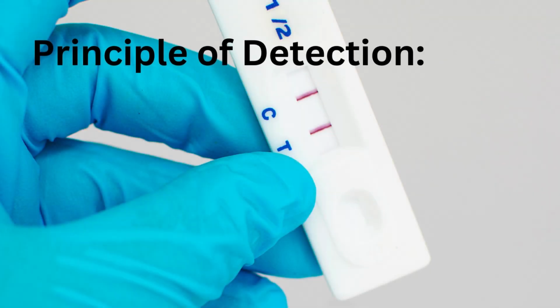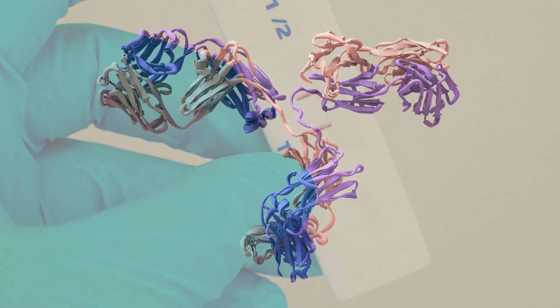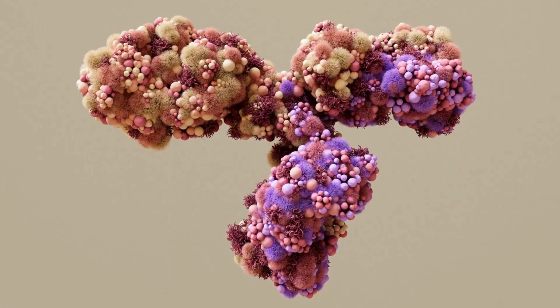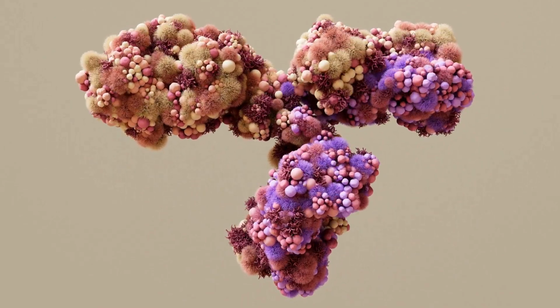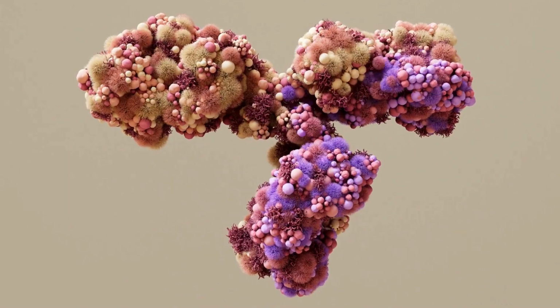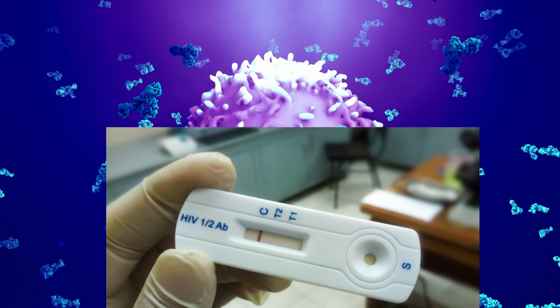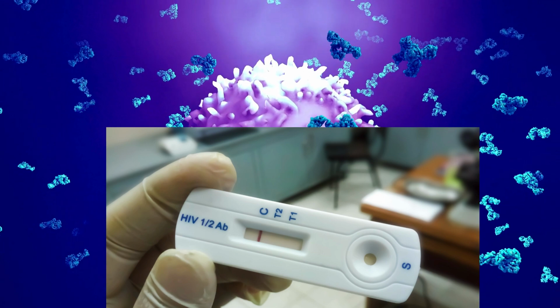Principle of detection. HIV test strips rely on the principle of antigen-antibody reactions. When a person is infected with HIV, their immune system produces specific antibodies to fight the virus. These antibodies are the primary targets of most rapid HIV tests.